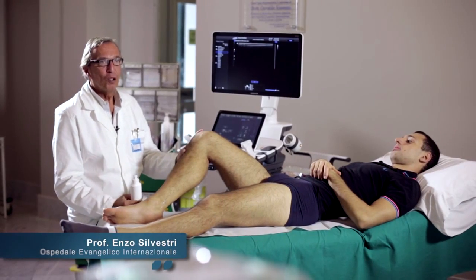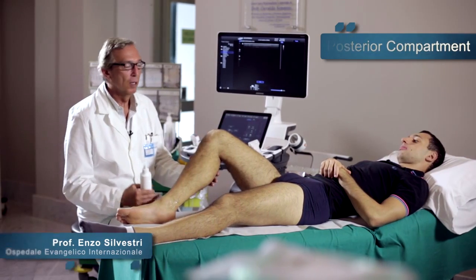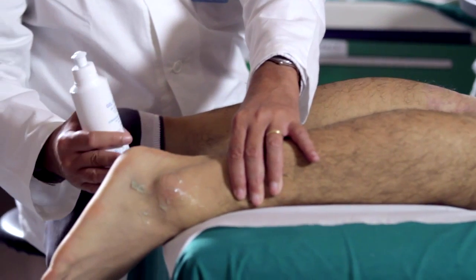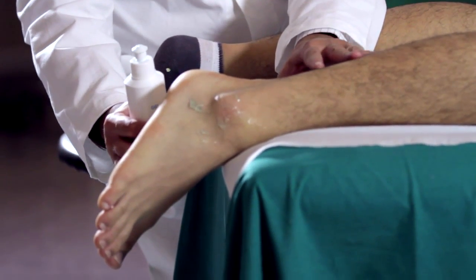For the study of the posterior compartment of the ankle, we invite the patient to lie on his stomach, so we can easily scan all of the structures. The position of the foot is very important. Feet should be outside of the bed to be able to perform dynamic maneuvers.